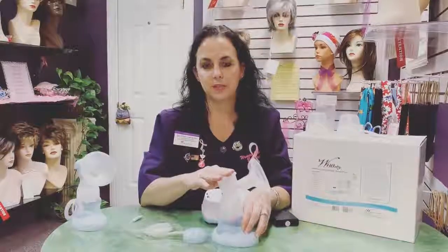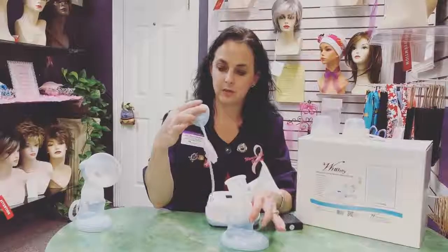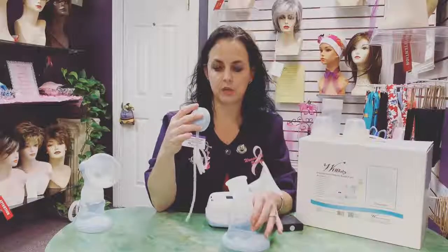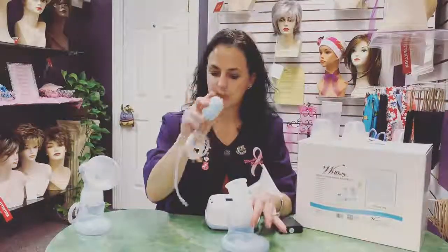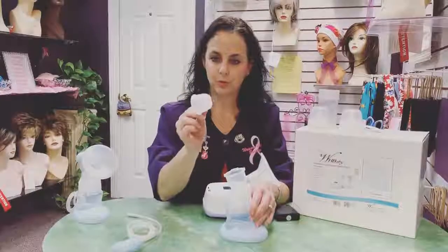Your breast pump is very simple to clean. Due to it being a closed system breast pump, when you take the cap off, you do not have to clean the hoses. Once you get water in these hoses, it can get into your motor and cause damage. This way you don't have to do it. So when you get ready to clean this, take the cap off, set it to the side, and don't worry about the hoses. You're gently going to pull out your diaphragm.